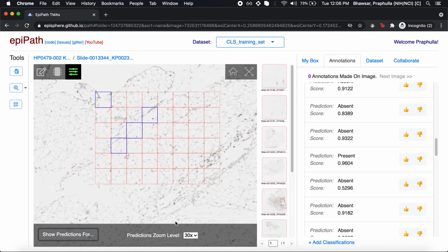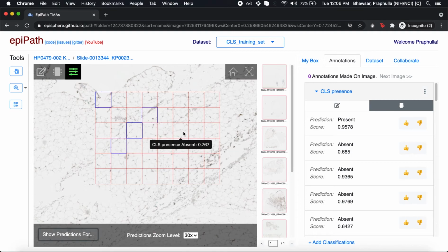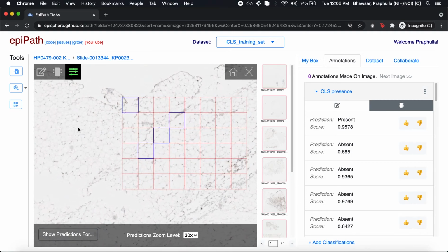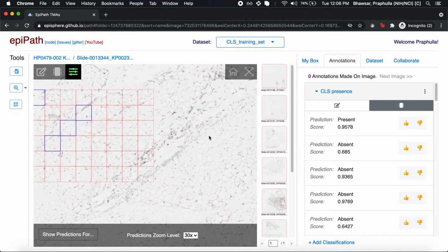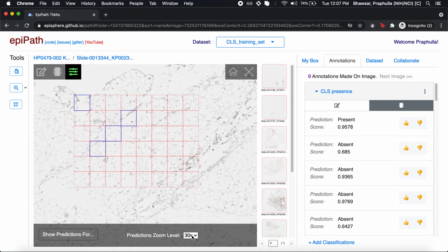And these options should allow faster annotation of the image, since you don't have to look for a specific section. And if a section of the image was already analyzed by someone else, as long as you have the same image and the same model, which you should if you have the same data set, you will be able to automatically get those analyses for free and just start giving your own feedback on those images. So this should enable faster training and faster active learning, and thus lead to more performant models.